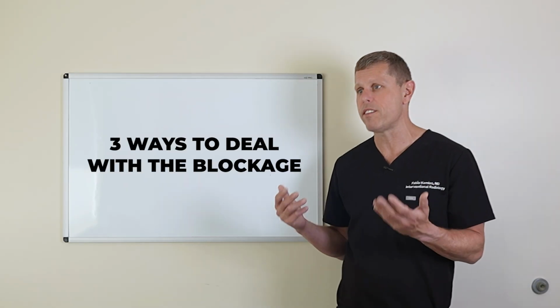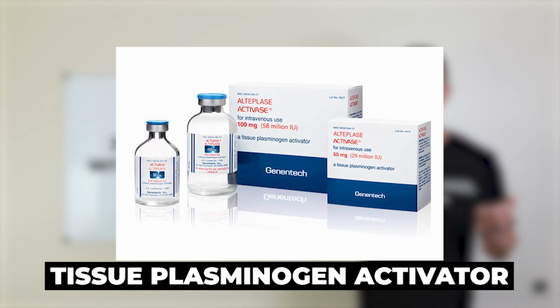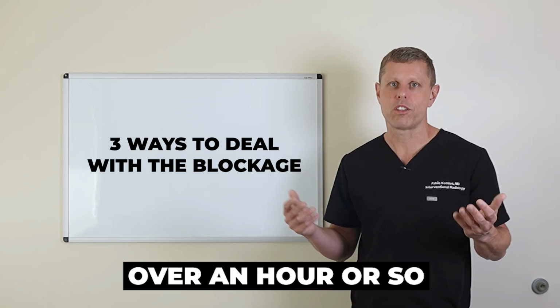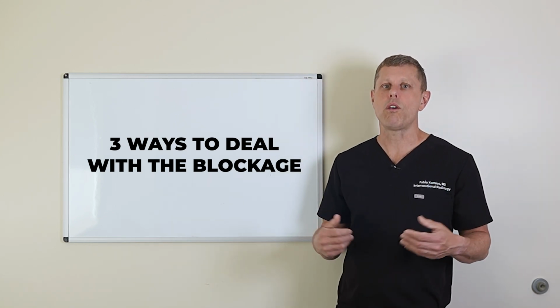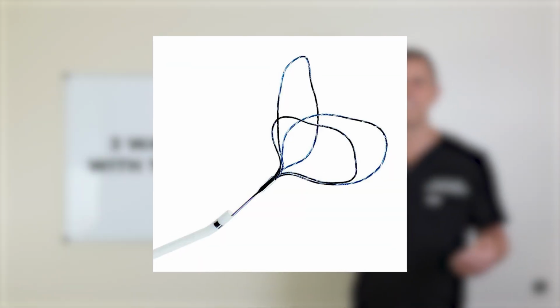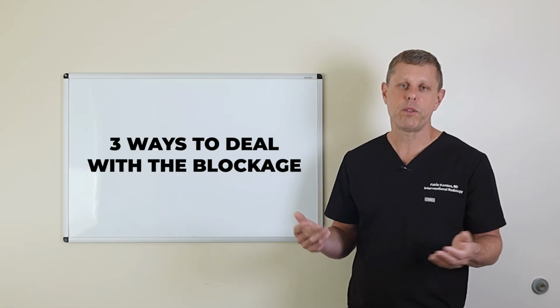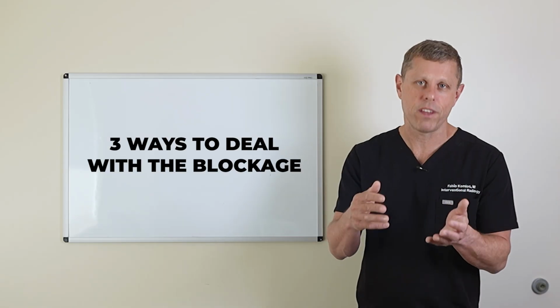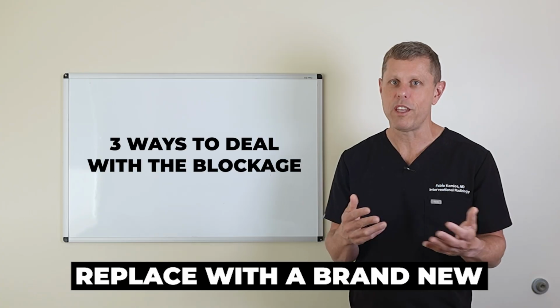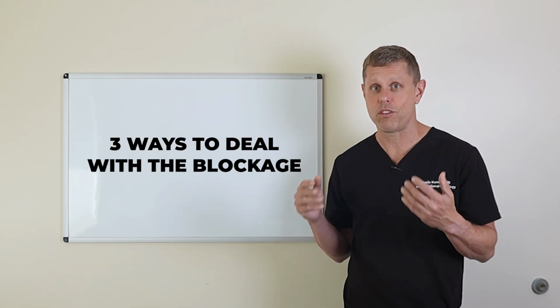There are 3 ways that we can deal with them. One way is we can inject a medication called TPA and infuse through the catheter. That has to be done in the hospital because we usually infuse over an hour or so to try to clear the blockage. The second way, sometimes if you have a catheter in the chest, for example, we can go from the groin and use a little snare to strip and clear the tip of the catheter to make it work better. And the third option, that's probably what we use more often because it's more long-lasting, is just to take the catheter out and replace it with a brand new catheter that then will work fine, because it's not going to be going through that fibrin sheath, through that scar tissue.